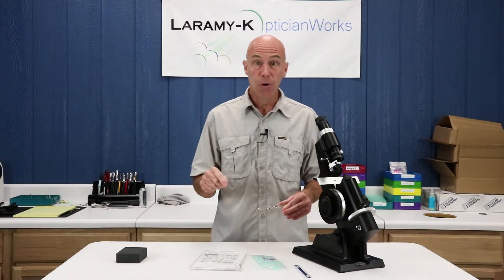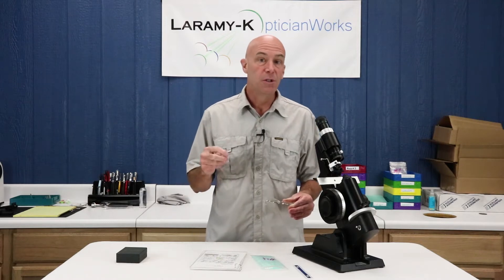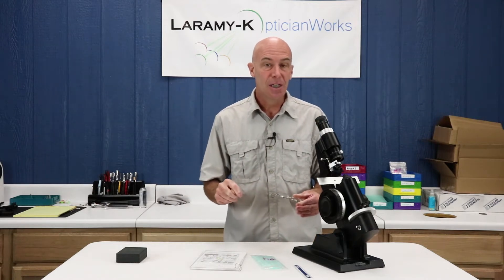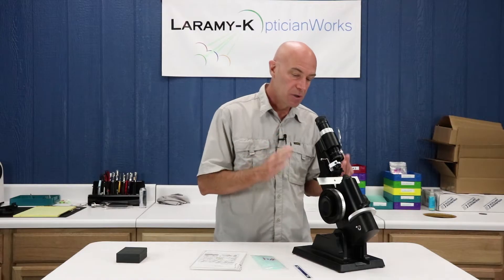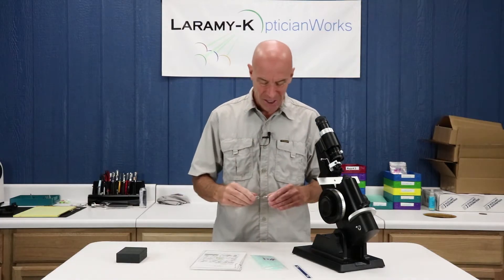We're going to take a near PD measurement or verification, we're going to check our segment height, and we're going to learn how to use the lens meter to read the bifocal power — which is kind of weird, so hang on, we'll get there.